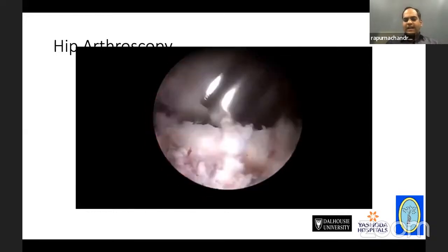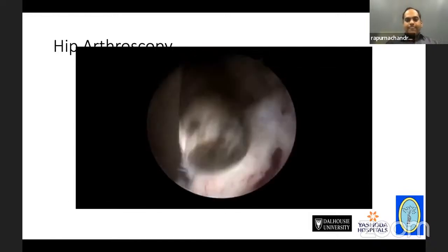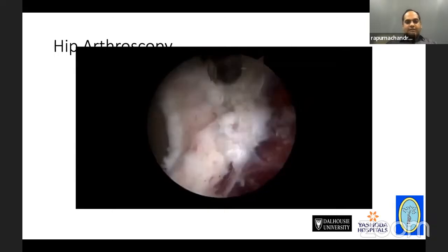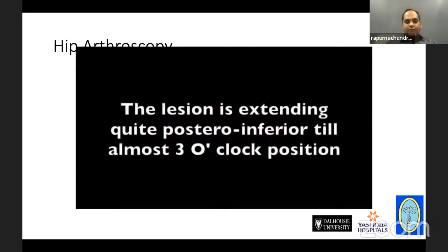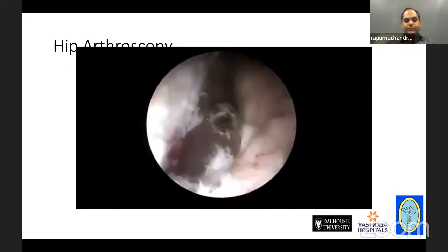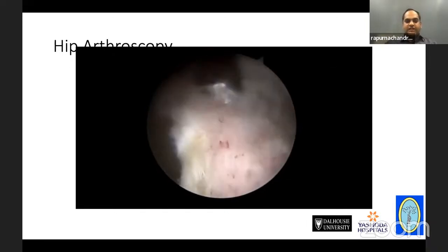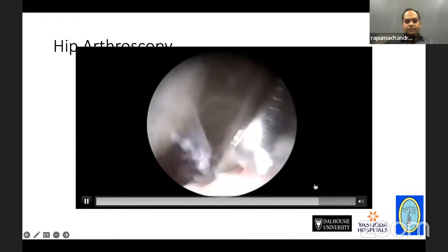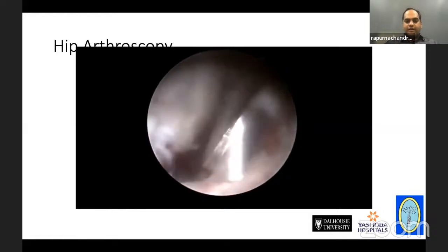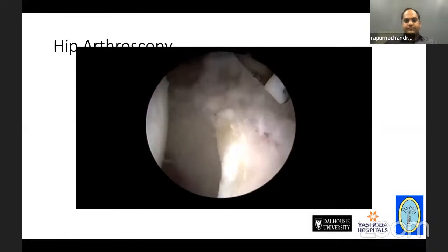That is what I decided to do in this case. So you can see that the normal cartilage is a landmark. The chondrolabral junction, what we call, is a landmark till where I would go to resect posteriorly. This is already extending into the posterior, the pincer deformity. You finish the resection gradually. Start from medial, go superior, and come posterosuperiorly, and finish your resection.